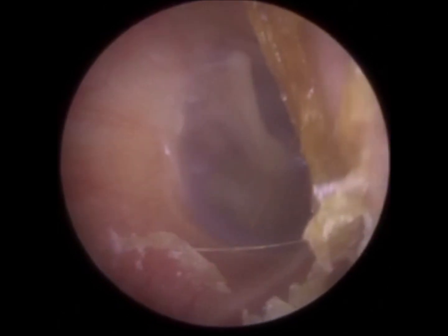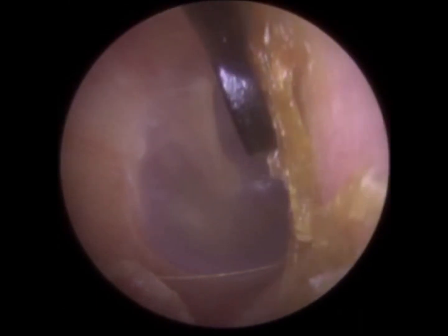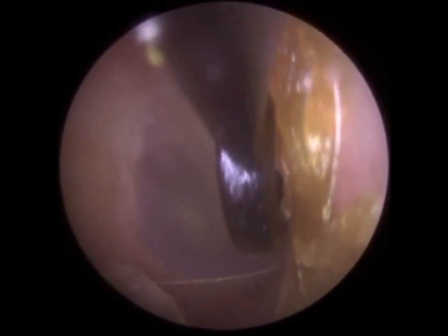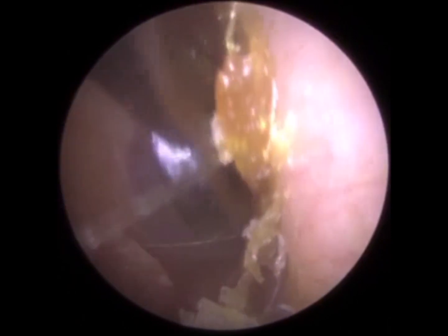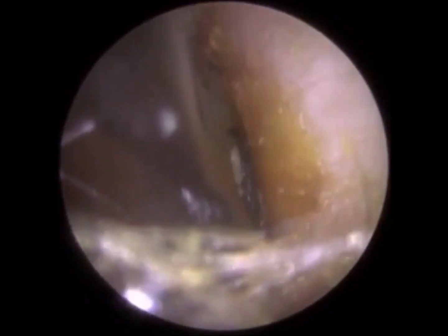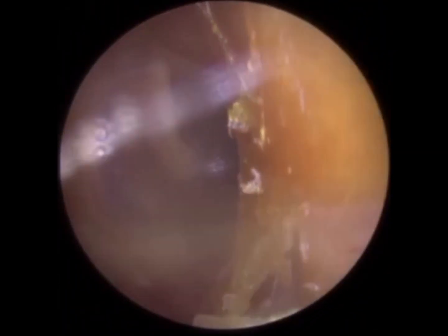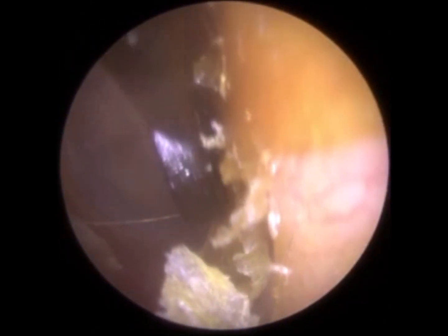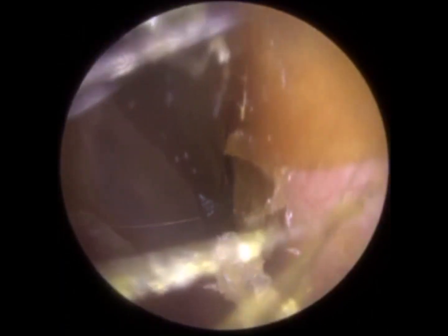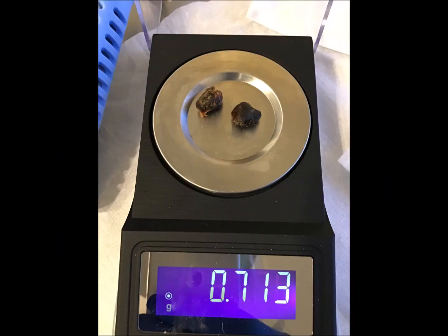Sorry if I'm yawning — it's been a long few days, long few weeks actually. Not been getting home till late; it's busy at the clinic, so I apologize. Just some residual dead keratin — I wanted to get this out for the patient. I'm using the jobson horn, just hovering over the canal wall, being delicate — I don't want to put too much pressure against the canal wall because that will be uncomfortable. A bit further in now, we're on the cartilage portion, so we can put a bit more pressure. I've moved this dead keratin forward and it's all now in the cartilage portion. And there we are — just released that dead keratin. Both ear canals are very healthy; tympanic membranes intact. No light reflex, but sometimes we don't have a light reflex and it doesn't mean there's anything wrong.